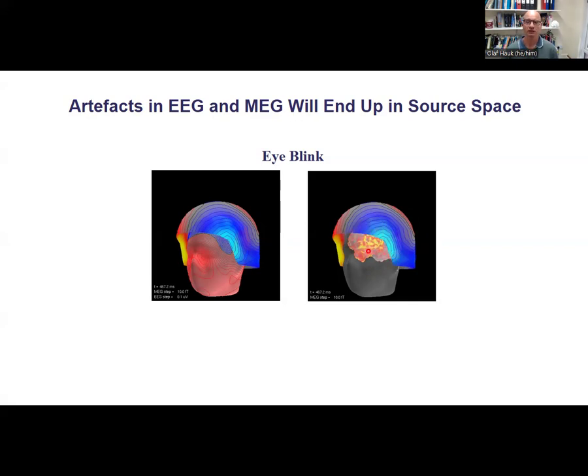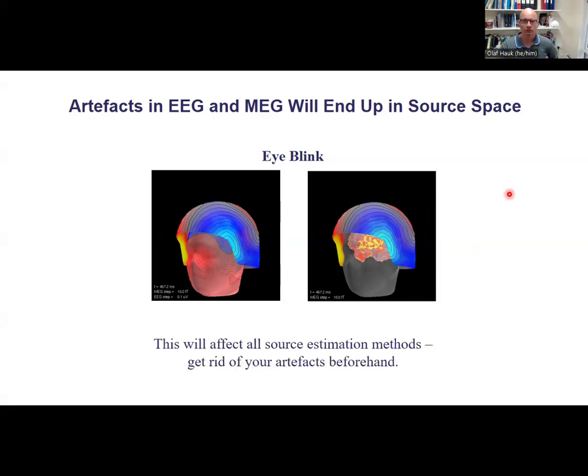You can't really see that here, but it's not surprising because the EEG and MEG topographies are symmetric. So whatever you put in, you will get something out. That means there will be some sort of brain activity associated with it. So it's better to avoid that.